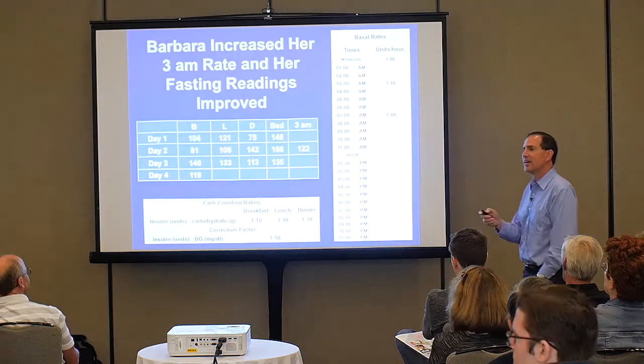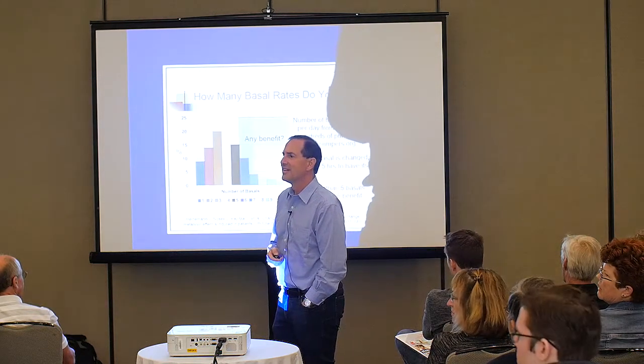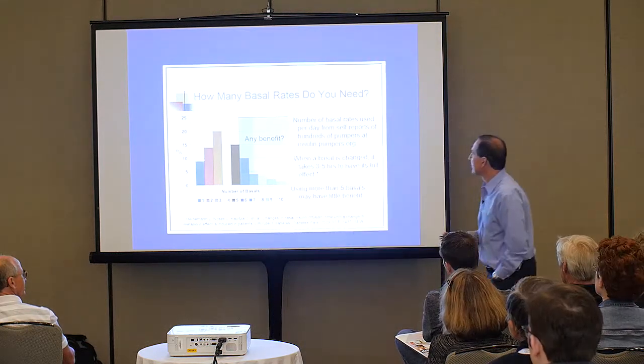Okay. It also helps with the Medtronic pump. Like I have one set at 3 and one set at 4. Yeah. And sometimes I play around with the 3 o'clock one being the start. Sure, that makes good sense.